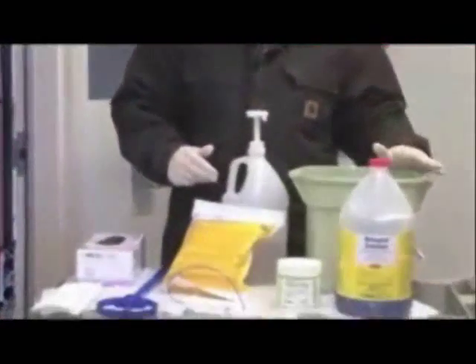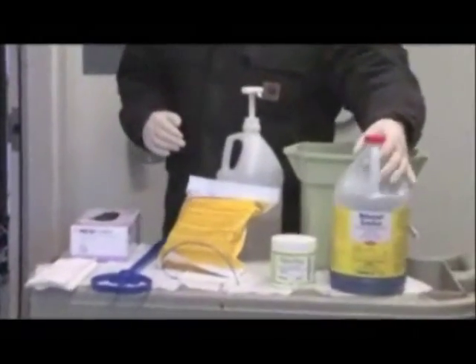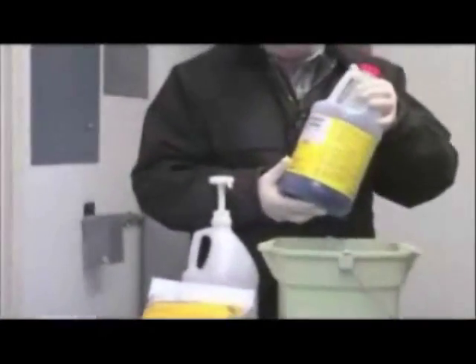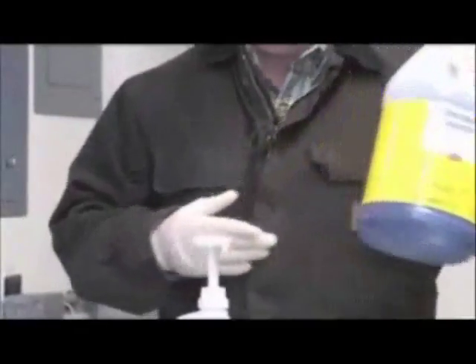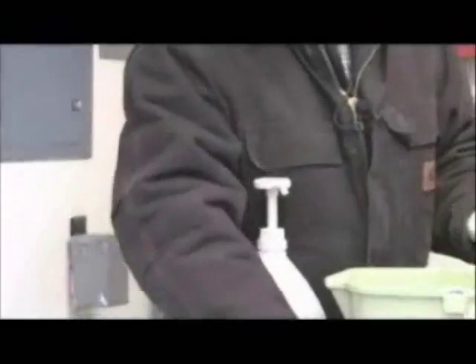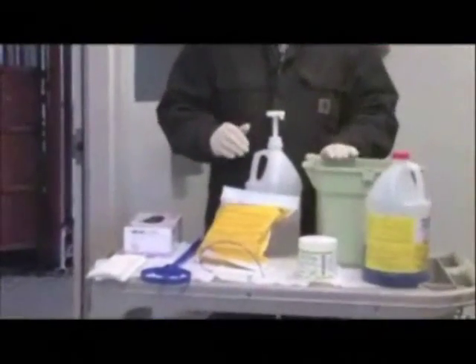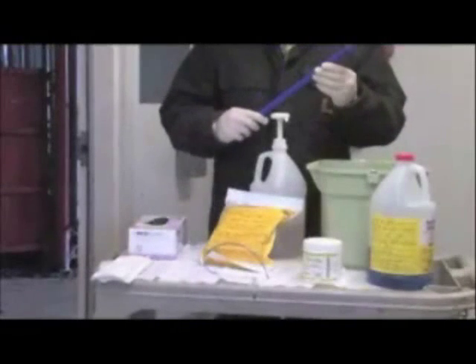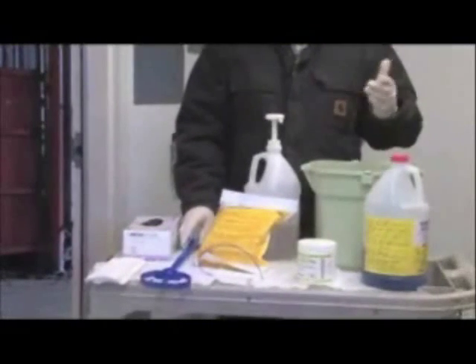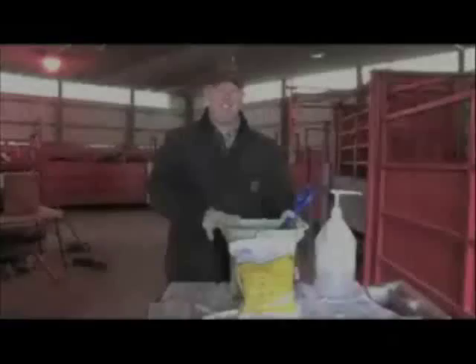Additionally, you will need a bucket of water that contains a mild disinfectant. Some of the disinfectants commonly used include Nalvasan or Effersan, both of which should be mixed at the recommended dilution level into the water. This allows you to clean the CIDR applicator or the CIDR gun between each cow to minimize the transfer of infection or disease from animal to animal.